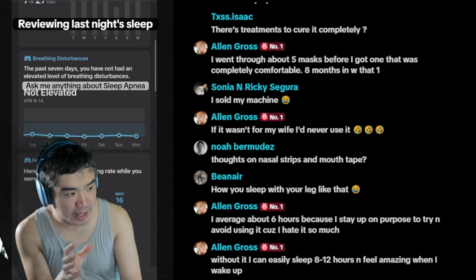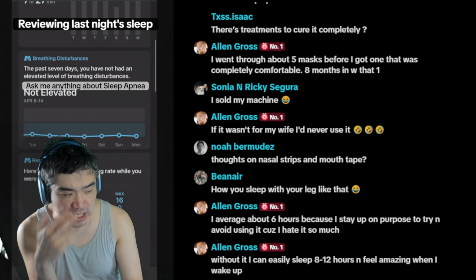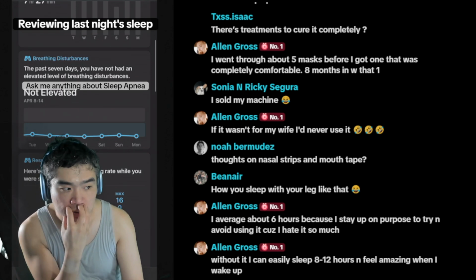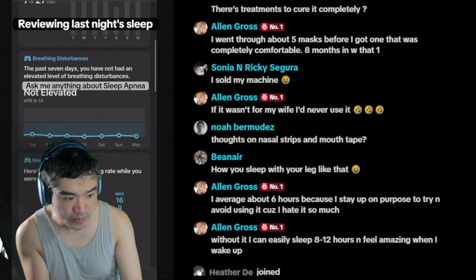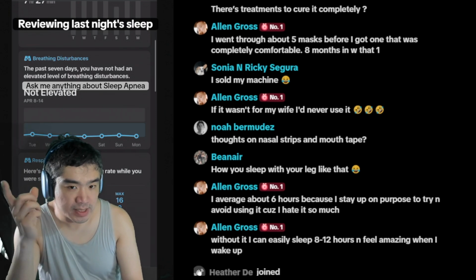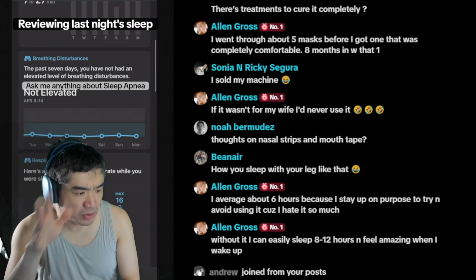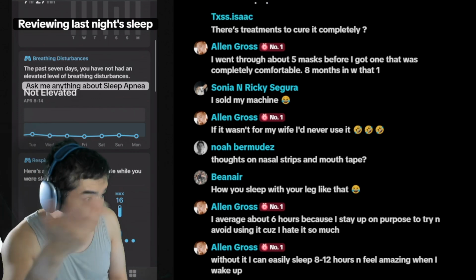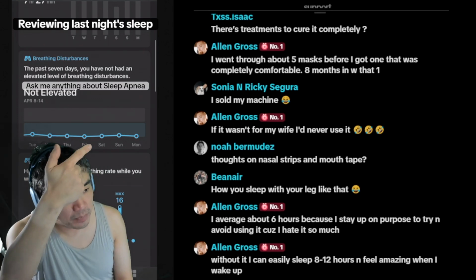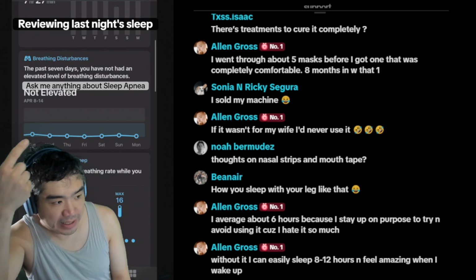So if you're saying you're sleeping better without the machine, well, the machine was measuring your events per hour while you were masked up, but without the mask, there's nothing measuring your events per hour anymore. So I would say, obviously, whatever you do, I trust that you're working with a doctor to figure out what the next steps are. But one thing I can maybe suggest is to start wearing this.